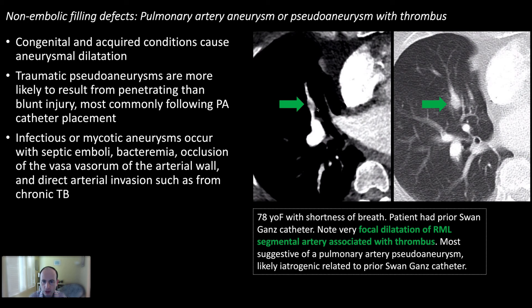An interesting case: focal dilation of a pulmonary artery segment with a small filling defect. This patient recently had a Swan-Ganz catheter, and this is actually a small pulmonary artery pseudoaneurysm with a tiny bit of mural thrombus — not a pulmonary embolism.